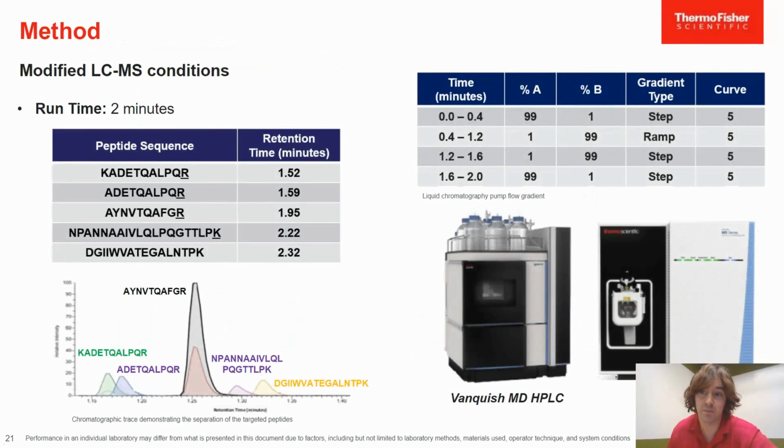The extra purity of the samples allowed the runtime to be shortened to 2 minutes, while still providing analytical separation of peptides. All other LCMS conditions remained constant from the previous method, except retention times, which had shifted forward due to increasing the gradient.